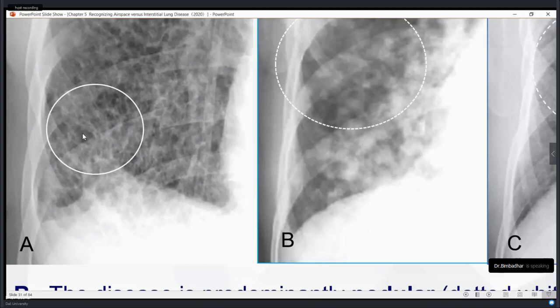And when I go down to secondary bronchus levels, to tertiary bronchiole levels, and then finally to the alveolar tree, the diameter of the pulmonary vessel branches will be the same as the bronchial branches. Sorry, it will be the same as the pulmonary markings itself, right?